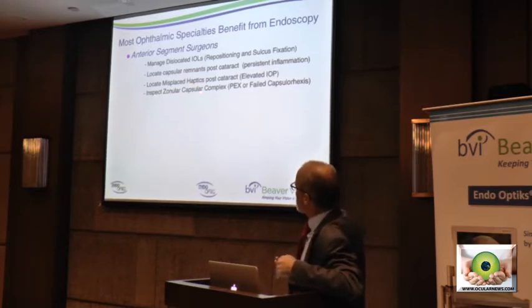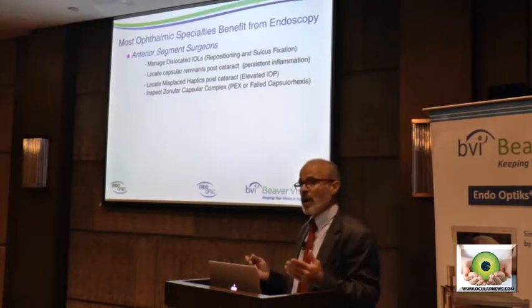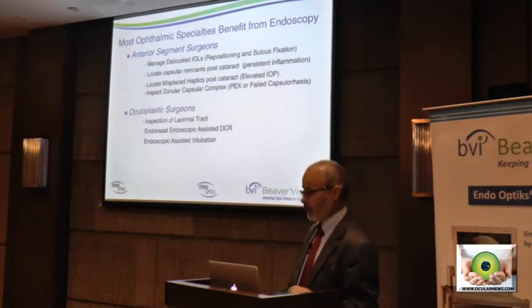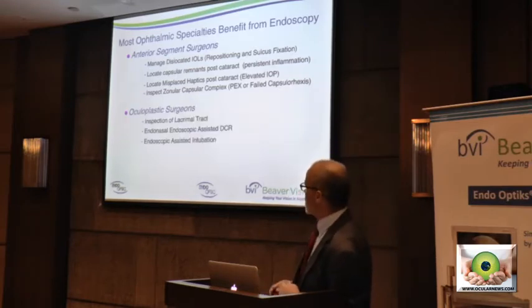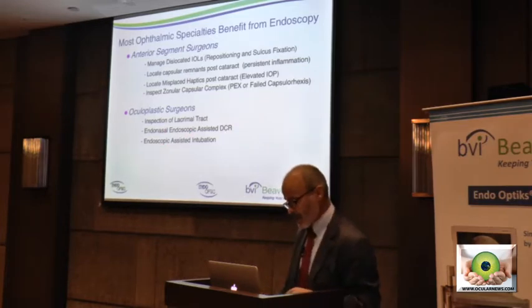And then, as I mentioned, inspecting the zonular capsular complex in those cases of pseudoexfoliation or a capsulorhexis that's gone badly. Oculoplastic surgeons use it for inspection of the lacrimal tract, endonasal endoscopic-assisted DCR, and endoscopic-assisted intubation.